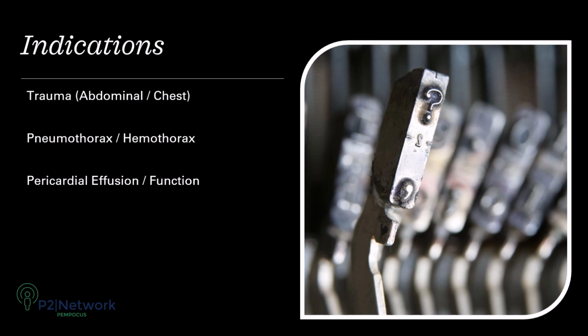Other indications for the FAST exam can include nephrotic syndrome assessment when looking for ascites, or as part of the general ultrasound performed for undifferentiated shock.